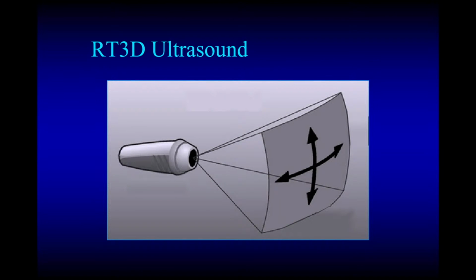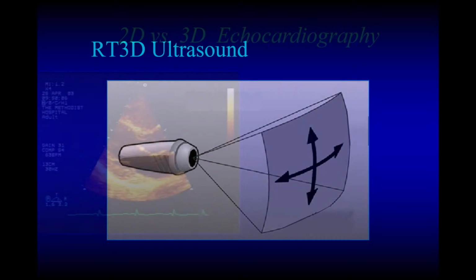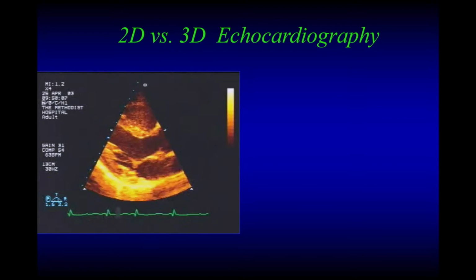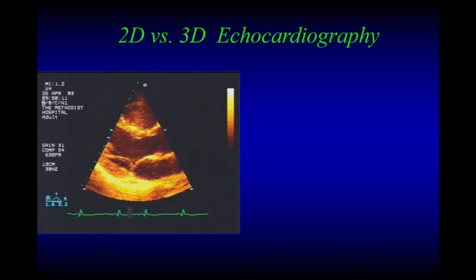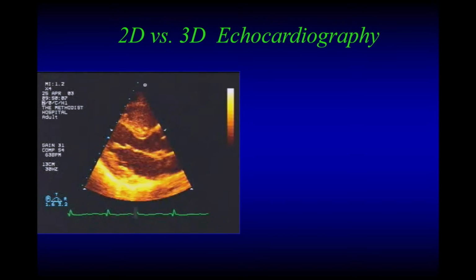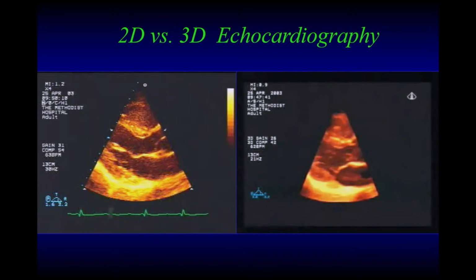And part of the, obviously, evolution of echocardiography is the application of 3D. I wanted to share with you, this is actually among our first images here back in 2003. So we're talking about 17 years ago. From a 3D point of view, and you could take a look at that.